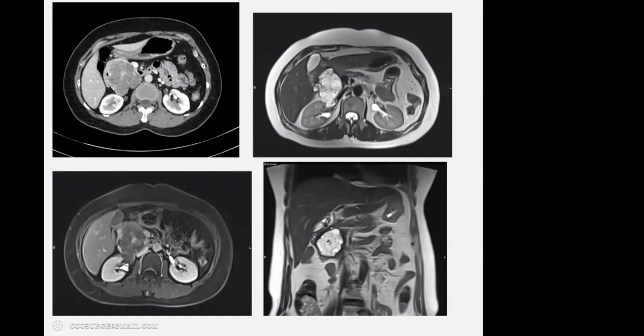Once we grab the data, the resolution of the axial plane, coronal plane, and sagittal plane would be the same, and it would be the whole volume data. So we can see the 3-dimensional picture as well. Whereas on MRI, we cannot do that.